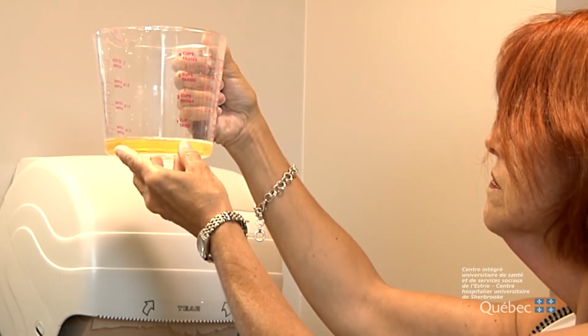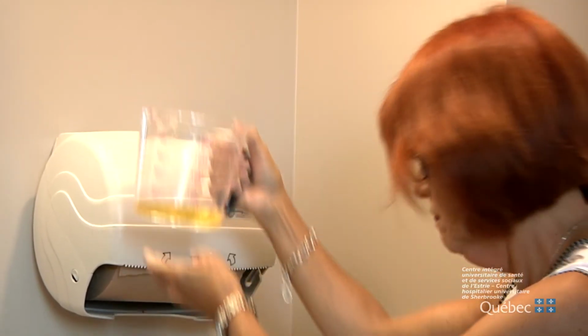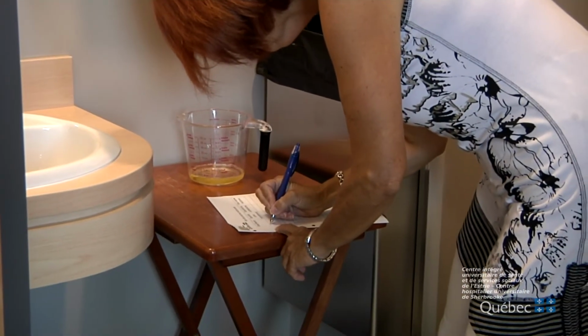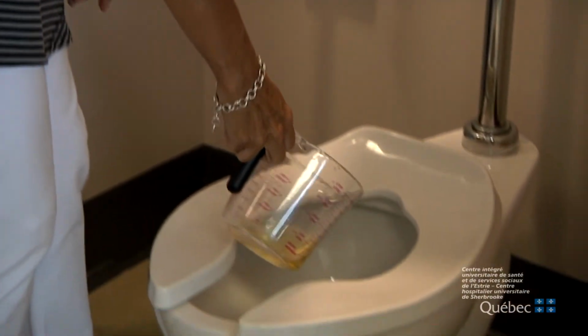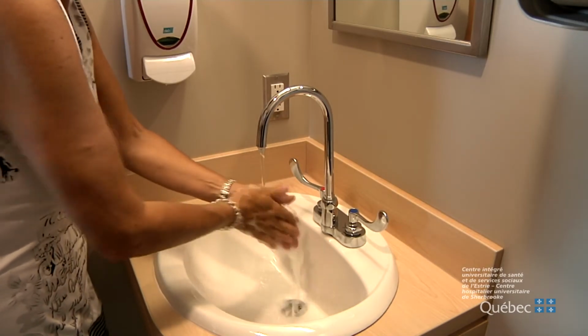After you have finished, measure the volume of urine in the cup in milliliters. Record the amount on your sheet. Dispose of the urine in the toilet. Wash your hands using the procedure that I described earlier.